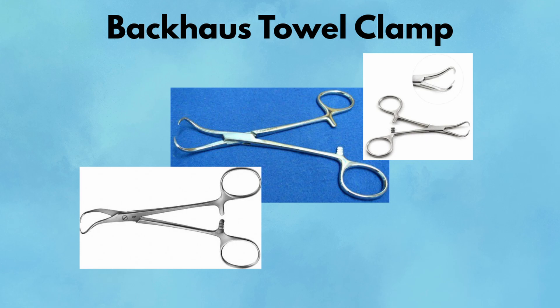Pearl: Always place towel clamps after prepping — they pierce the skin and must remain sterile. Pitfall: Be careful when removing; they can tear skin if twisted or pulled at an angle.